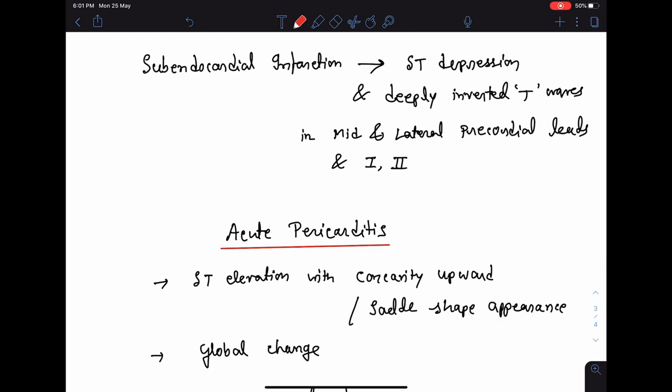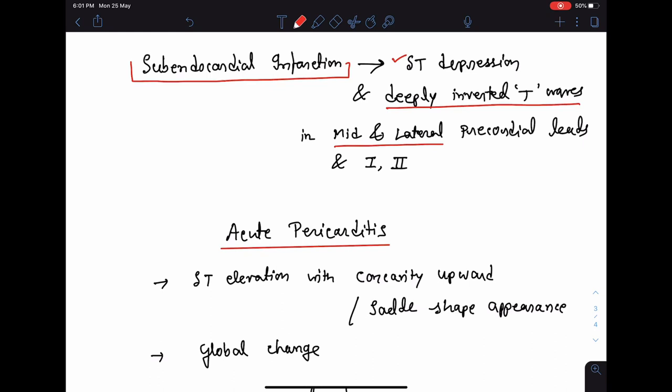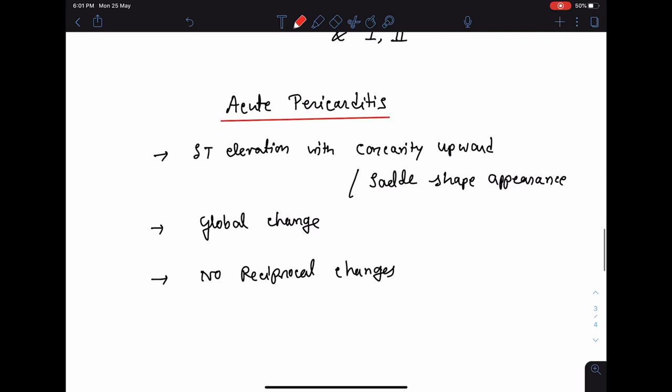To diagnose subendocardial infarction: it is not so well defined, but it is said that if there is ST depression along with deeply inverted T waves in mid and lateral precordial leads as well as standard leads 1 and 2, this is suggestive of subendocardial infarction.